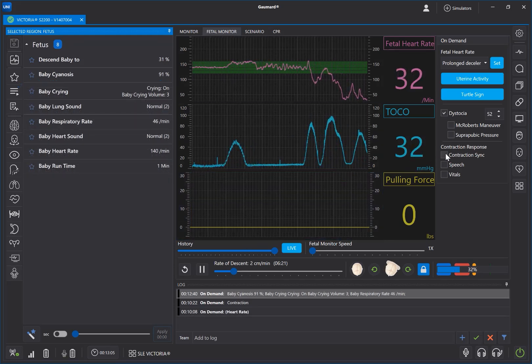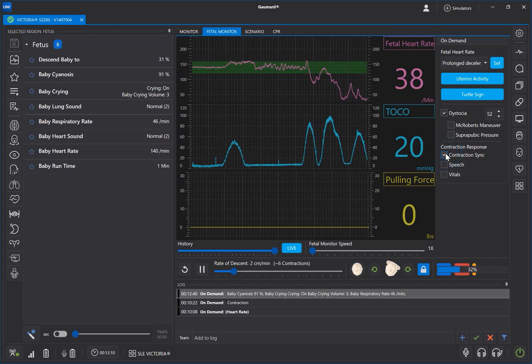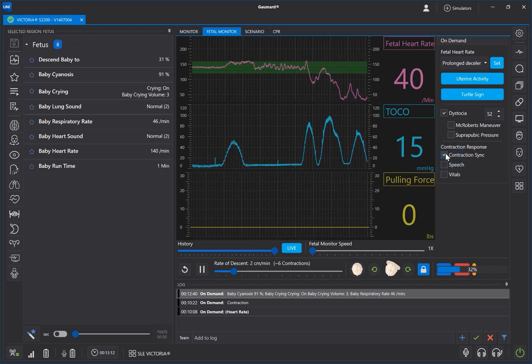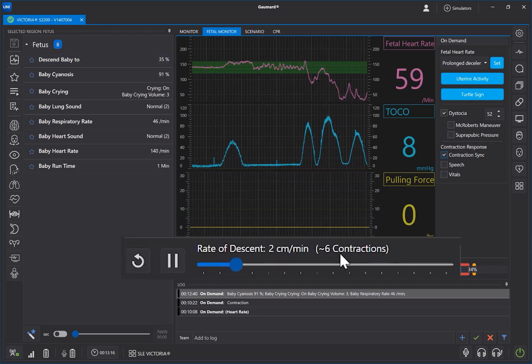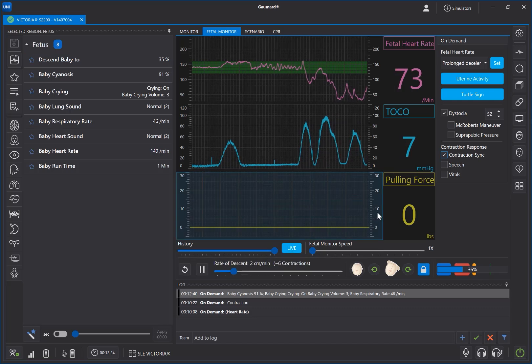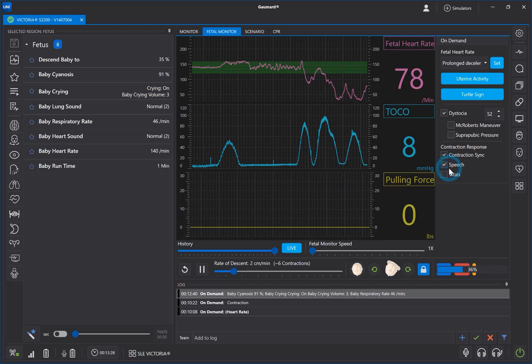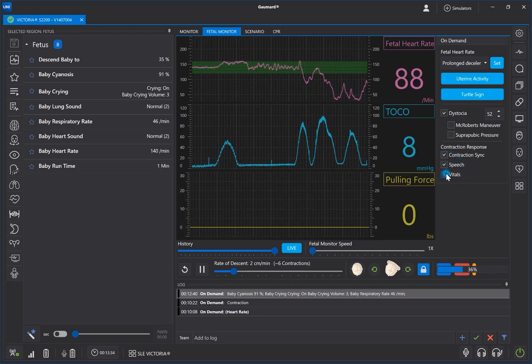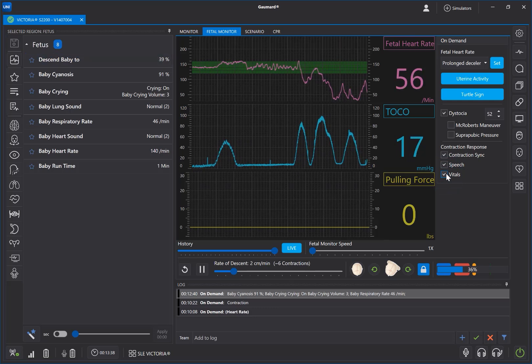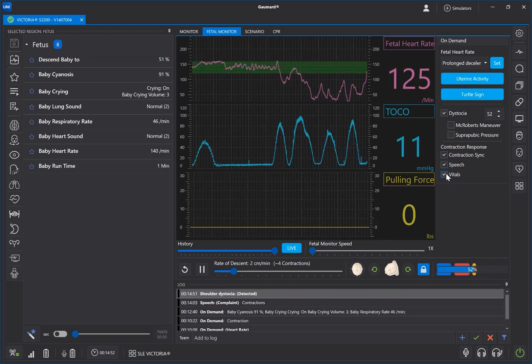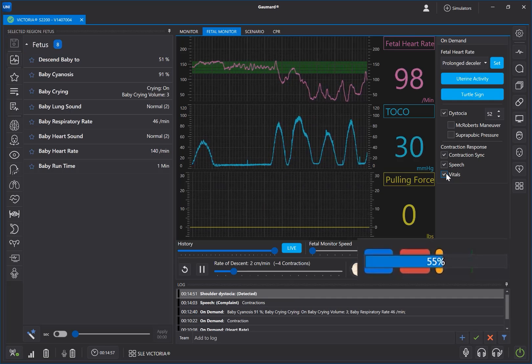The Contraction Sync box will advance the labor motor while the birthing simulator is having a contraction. If Contraction Sync is on, the rate of descent slider will estimate the number of remaining contractions instead of time. Speech will generate a yell to simulate the simulator straining during contractions. Vitals will cause a momentary elevation in maternal vitals during contractions.